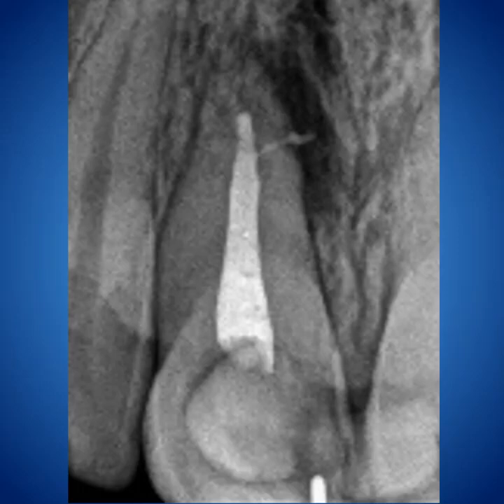And this is one of my cases whereby I obturated and I thought that I'm under by 1 millimeter, when really the external resorption due to the extensive lesion has made a lot of resorption in the apical region, and the apical constriction position and size has changed. And you can see the lateral canal being filled.